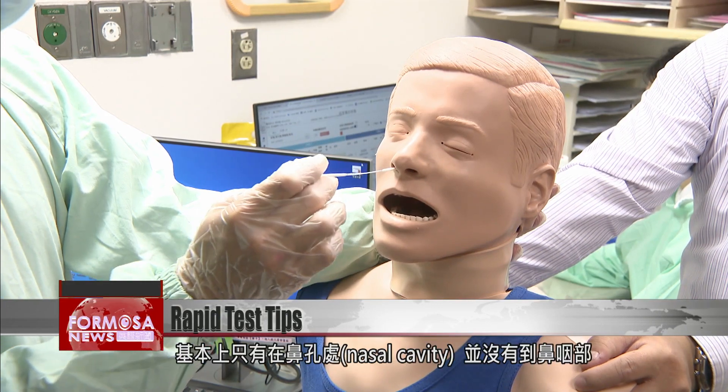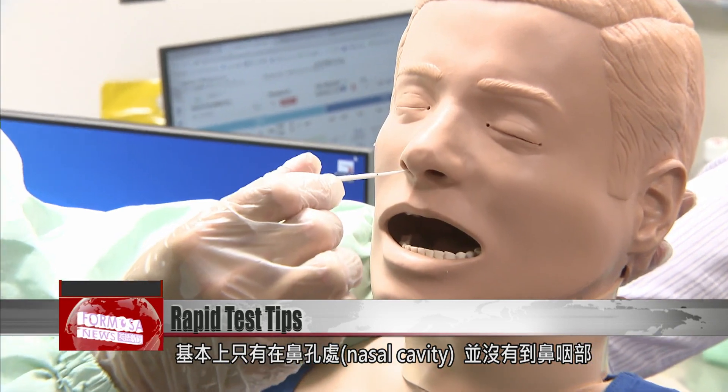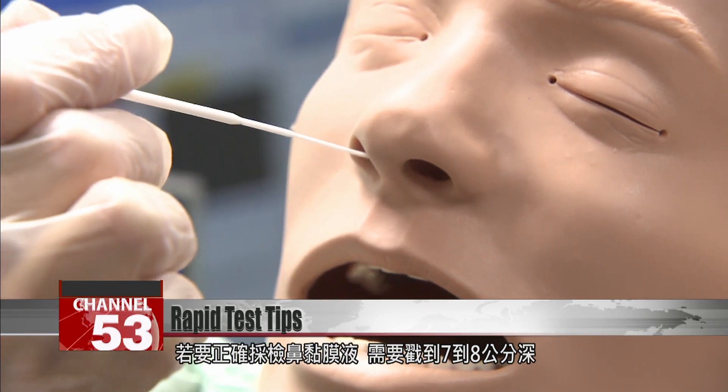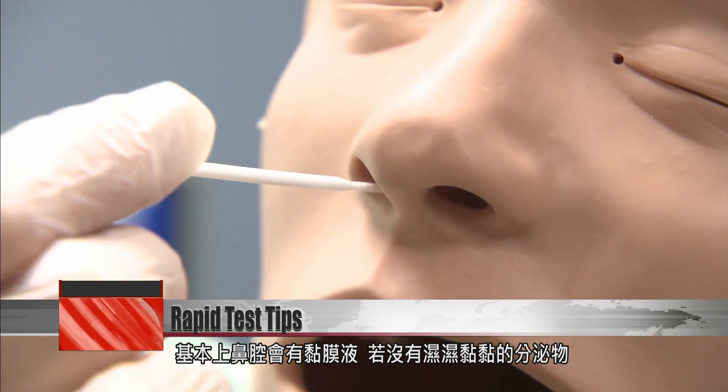The kit instructions direct users to insert the swab 2.5 centimeters deep. But the doctor says that at such a depth, the swab remains in the nasal cavity without reaching the nasopharynx. To correctly collect a sample from the nasal mucus membrane, it is necessary to reach as far as 7 to 8 centimeters in.